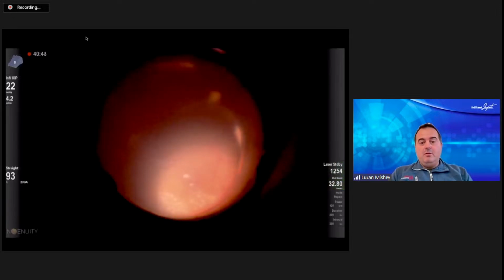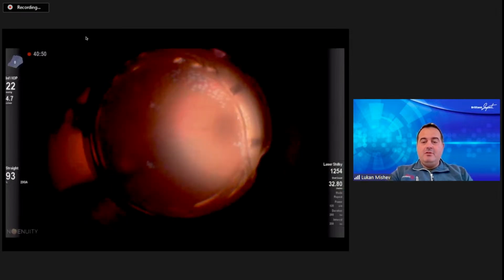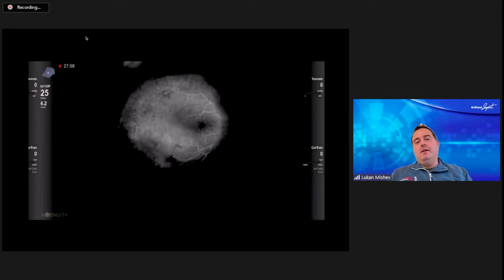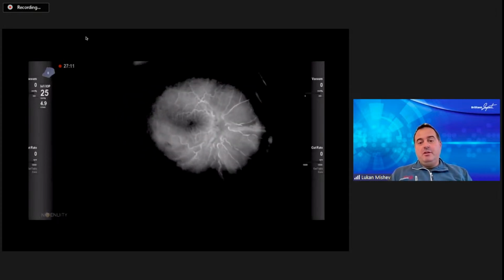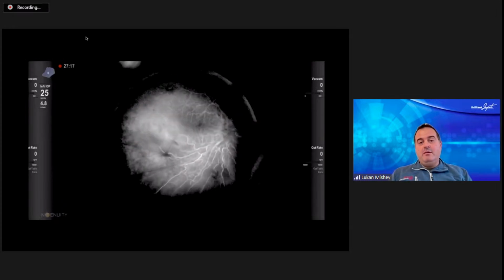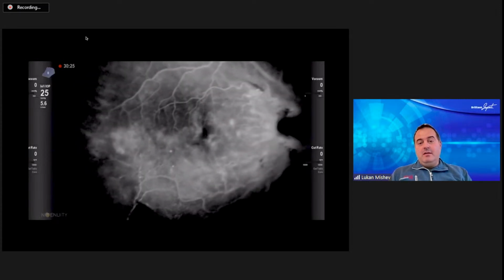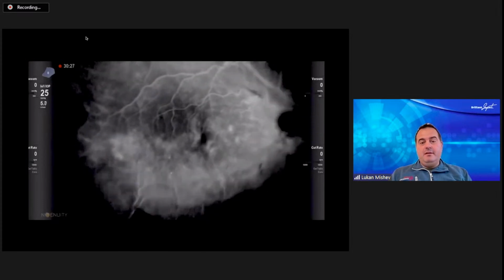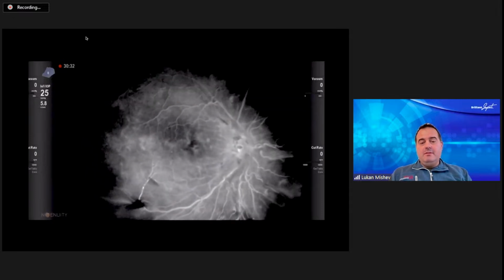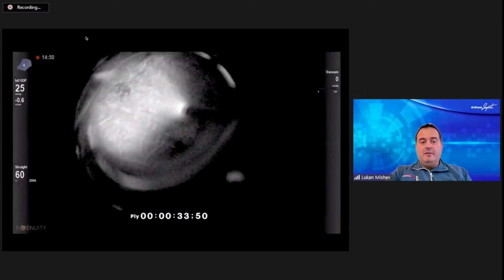So what I want to say is that we might be better at treating the retina and not damaging the healthy one. So here we have an advanced case of diabetic retinal disease. You can appreciate the areas of the capillary dropout, and you can see quite well where the retina is perfused and where it is not. Of course, we can evaluate leakage areas and hotspots in the macula. So, as Alan said, it all goes to your settings in order to see the image better.